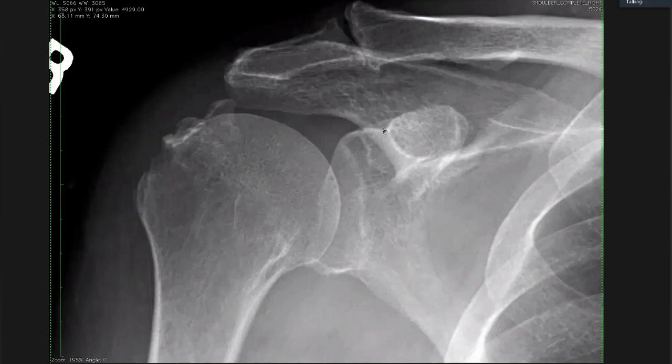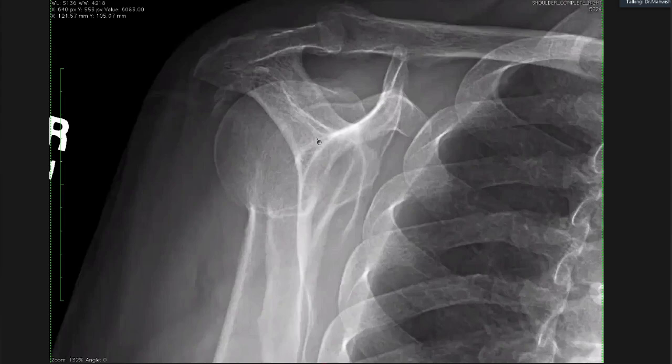So that's your front. So where is the fragment here, Dr. Mavish? Sir, the fragment that was appreciated is on the lateral aspect here also, and beneath the acromion. Exactly. So you see, this is the fragment, or probably a few fragments there. Right. So this is your subacromial space, the one we have seen on the last case as well, right?